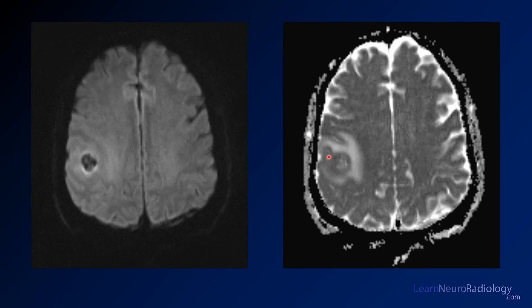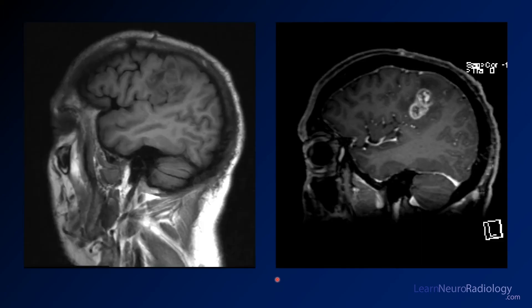On the diffusion images, particularly the ADC, there's a dark rim. On the DWI itself, it's centrally very dark due to susceptibility effect from hemorrhage centrally within the lesion. On the sagittal view, you get another idea of how heterogeneous and multilobular this lesion is — it's not completely enhancing and has central necrosis. This multilobular appearance is more common for GBMs, though metastasis would still be in the differential.